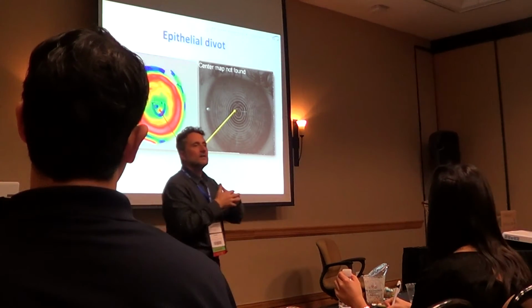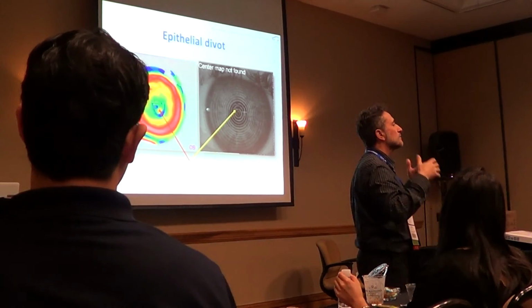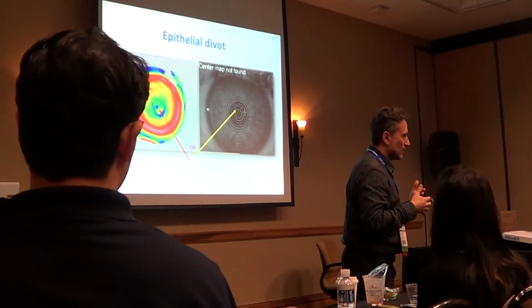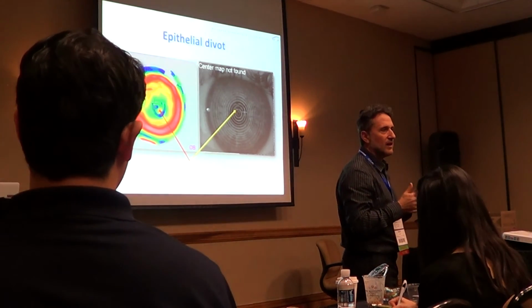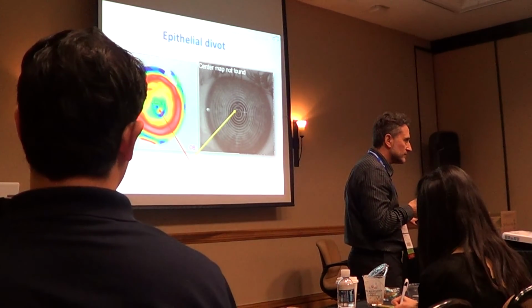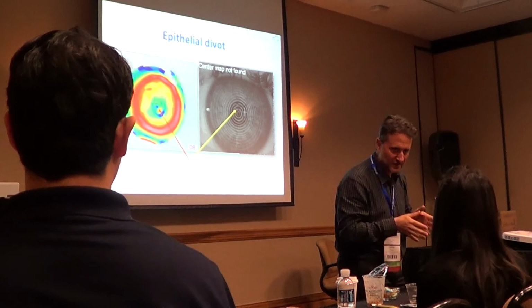That's a problem when the patient is not taking out the lens properly. 50% of the results of Ortho-k is patient management. 50% is fitting, 50% is patient.